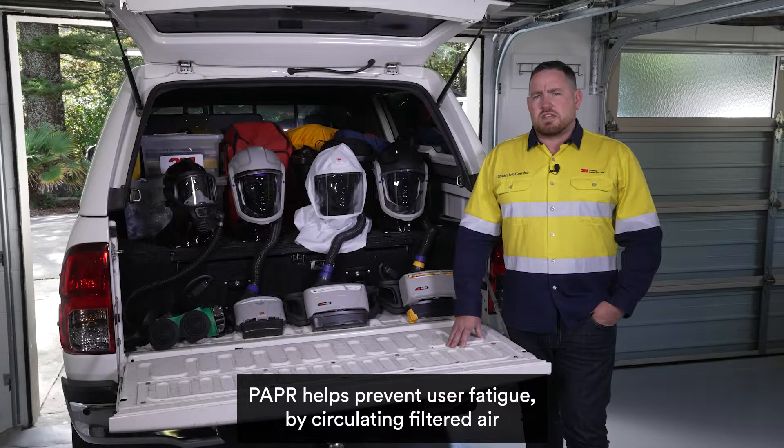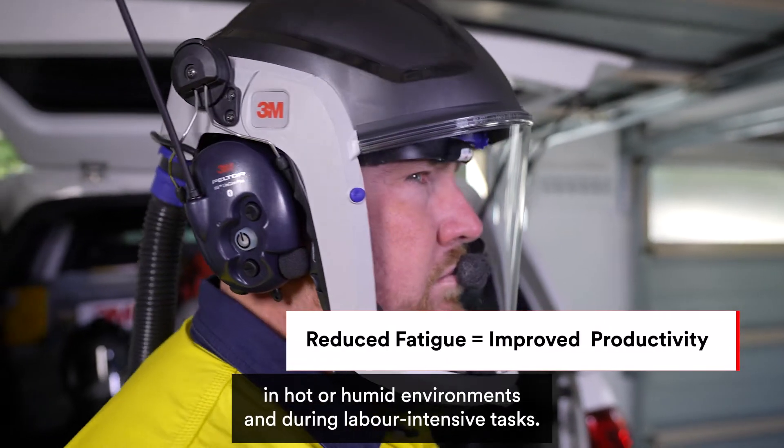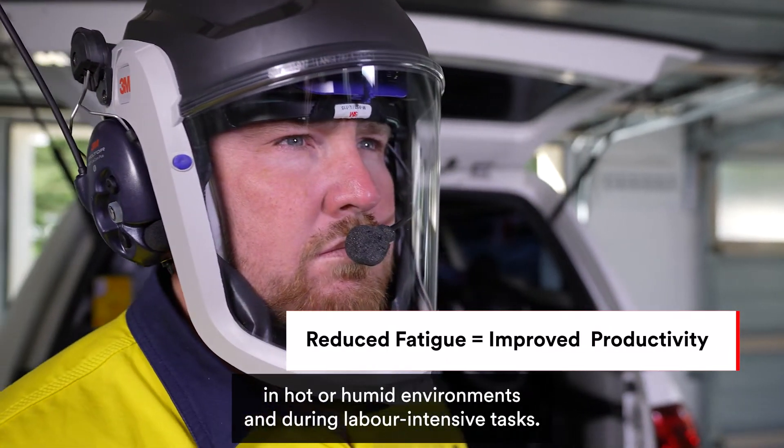PAPR helps prevent user fatigue by circulating filtered air around the head and face, which is particularly helpful in hot or humid environments and during labour intensive tasks.